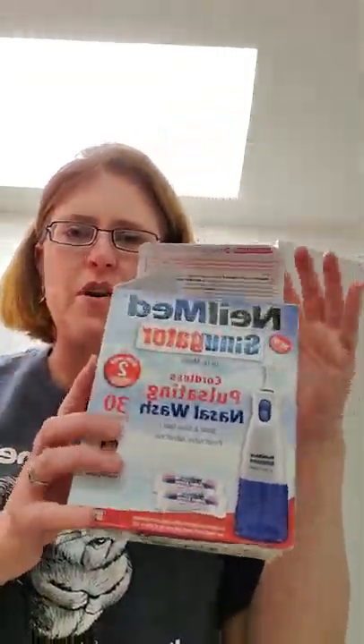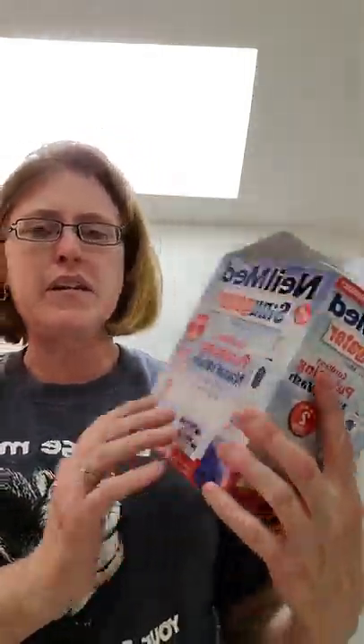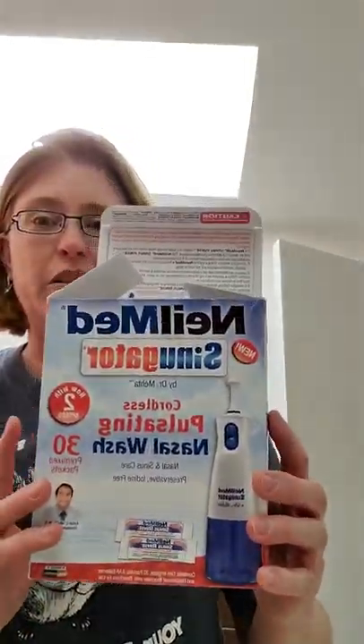Hi, my name is Suzy. I am going to show you how to use the NeilMed Pulsating Nasal Wash. I just bought this today — $24 at Walgreens. I've been having sinus issues and seasonal allergies.